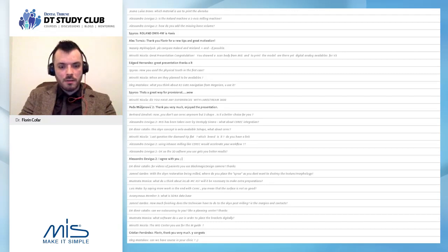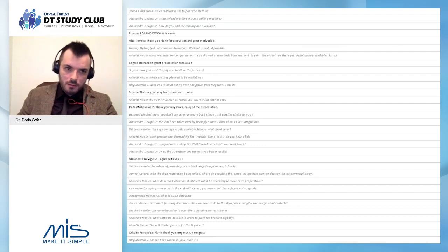Here, there are a lot of systems that will lose the natural morphology in the process. There are systems designed to soften everything. A lot of them actually, because in the past they were designed for cutback or for frameworks, which is where they were used. So all these kinds of systems will more or less destroy the natural morphology.